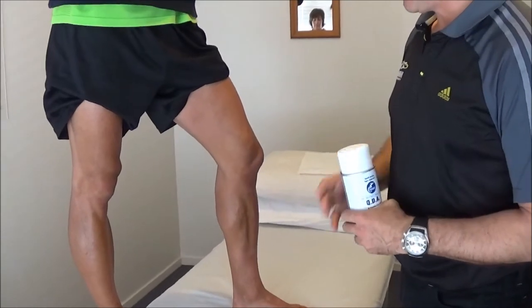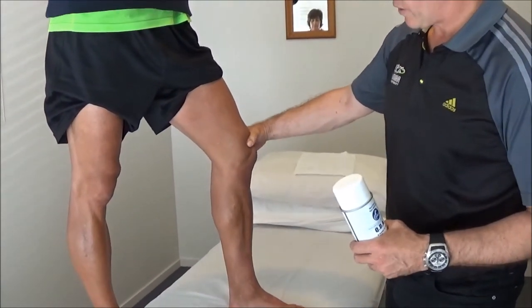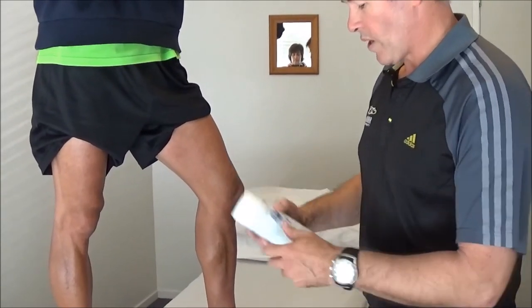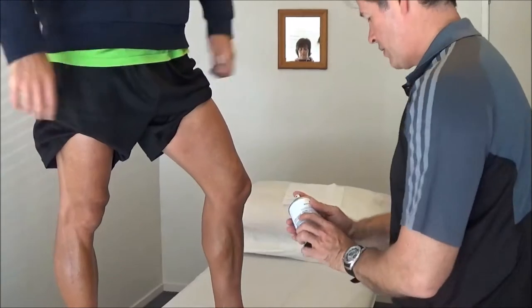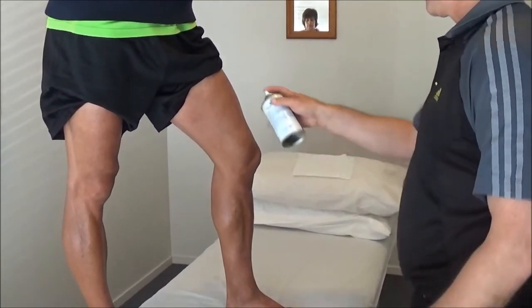What we're going to do now is tape up a medial ligament on the knee, so it'll be a sprained ligament injury. We're going to try and support through the inside, so we're going to spray our adhesive spray on first. Just have to give it a light spray, don't need to cover it completely.